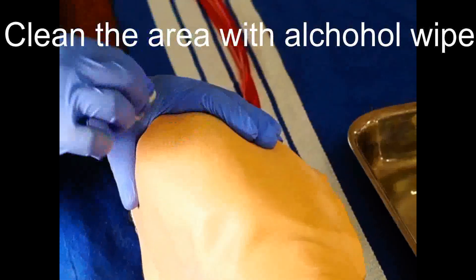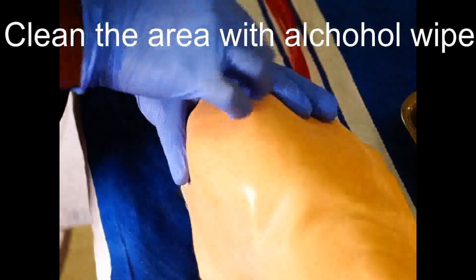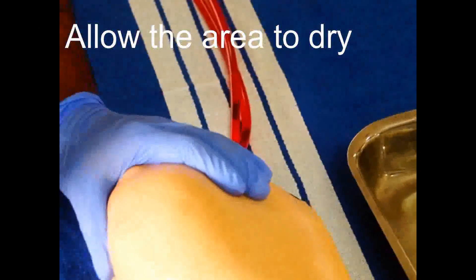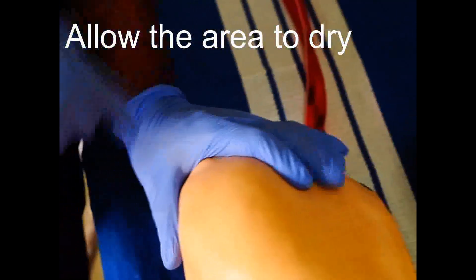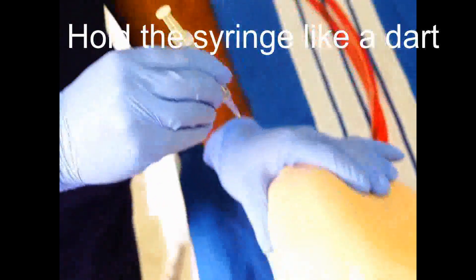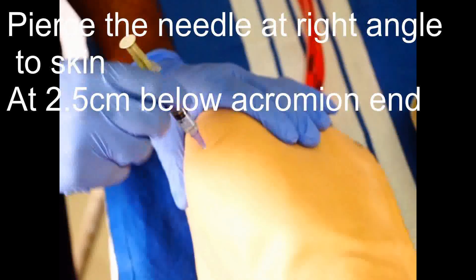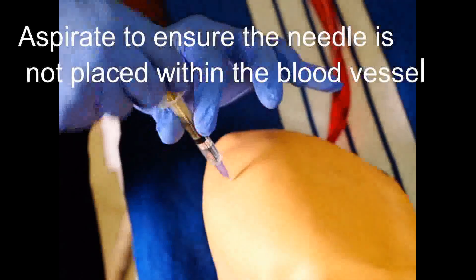Clean the area with an alcohol wipe and allow the area to dry completely before injecting. The injection is given approximately 2.5 cm below the acromion process. Hold the syringe like a dart and inject at right angles — approximately 75 to 90 degrees — to the skin.